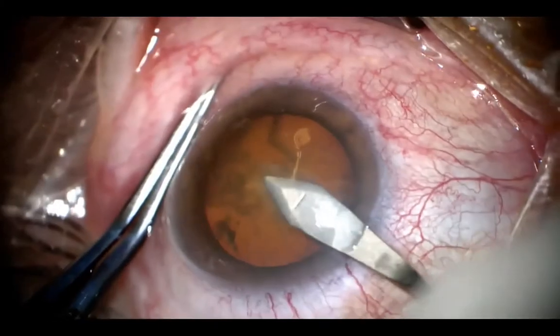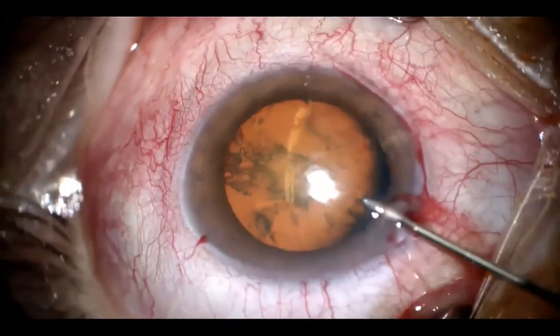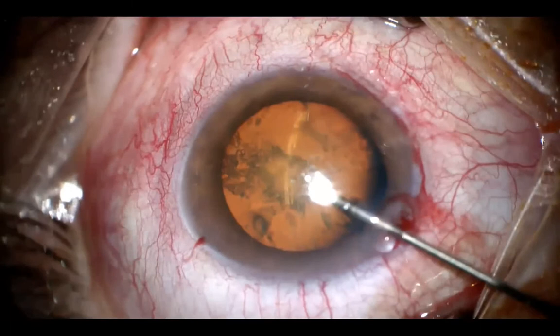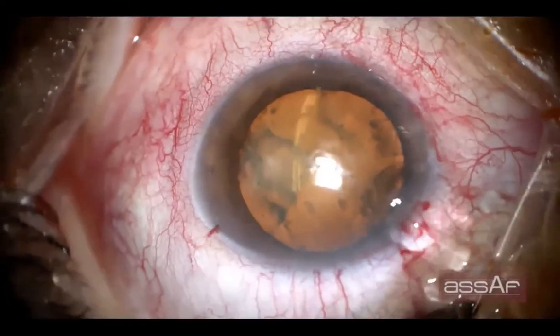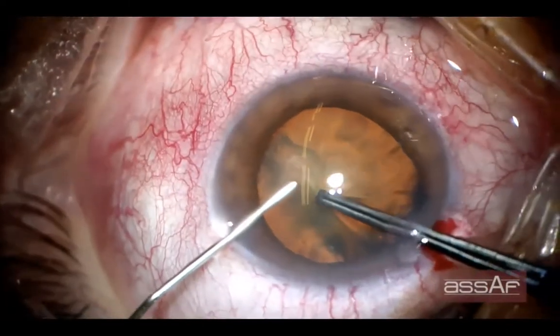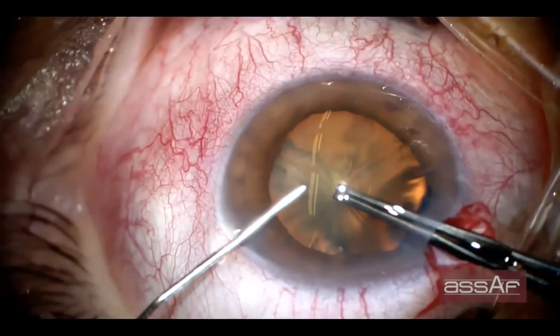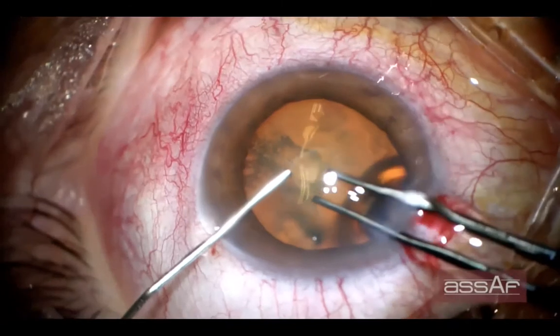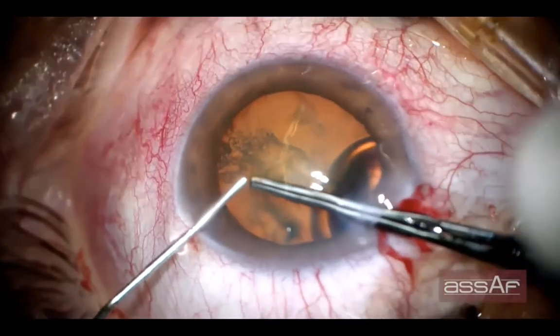So we start the phacoemulsification in the usual way, and while injecting OVDs inside the anterior chamber, you can see this black crescent surrounding part of the lens equator. This denotes areas of weak or absent zonule. Another sign is the corrugations of the anterior capsule, and these corrugations are due to weak or absent tension of the zonules on the anterior lens capsule.